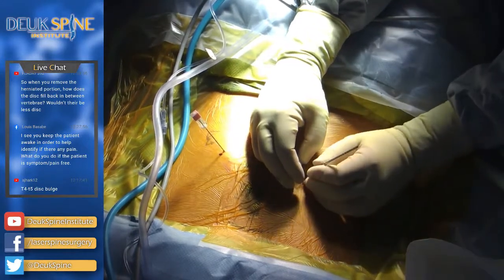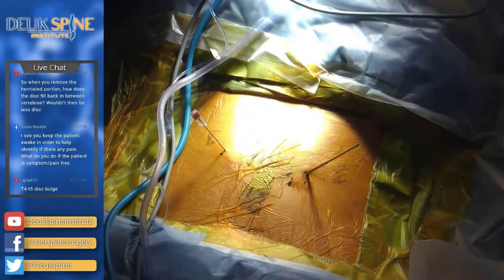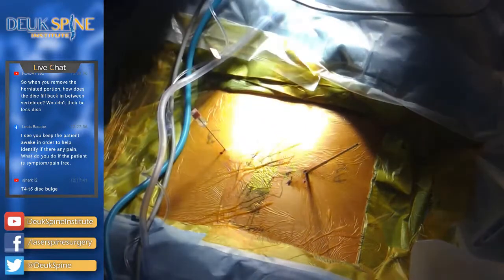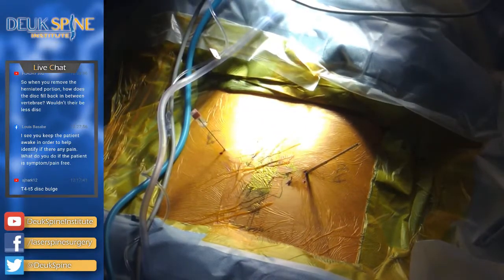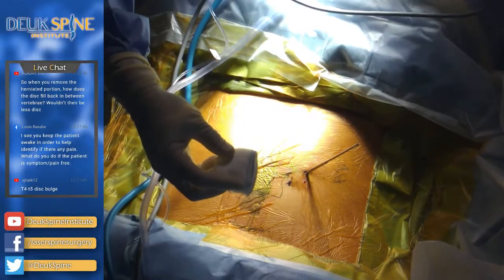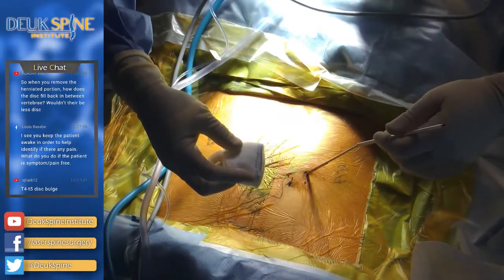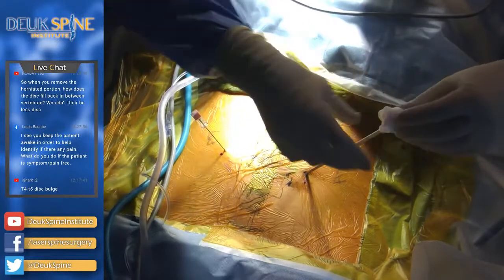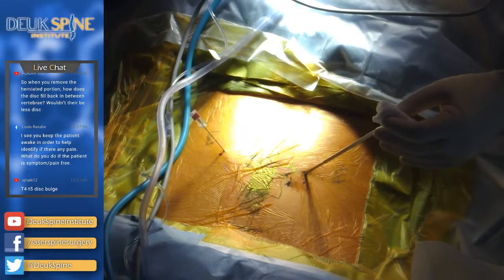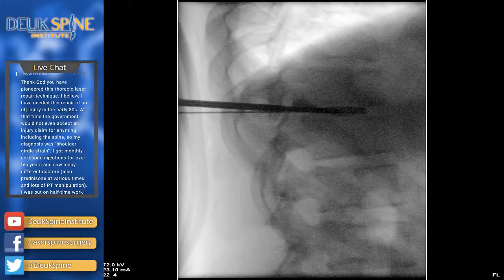The only thing we're removing is a piece of the jelly, the disc, that already left. So imagine you have a tube of toothpaste. You forgot to put the cap on, and you inadvertently put your hand down on the toothpaste, and you squeezed out a little bit of toothpaste, right? That's the situation that I'm dealing with. I need to remove the toothpaste that squeezed out. There's no filling it back up, and we're not removing toothpaste from the toothpaste tube. All we're doing is taking the stuff that's already squeezed out away. So this surgery doesn't remove disc material from the disc. It removes herniated disc from the herniation.